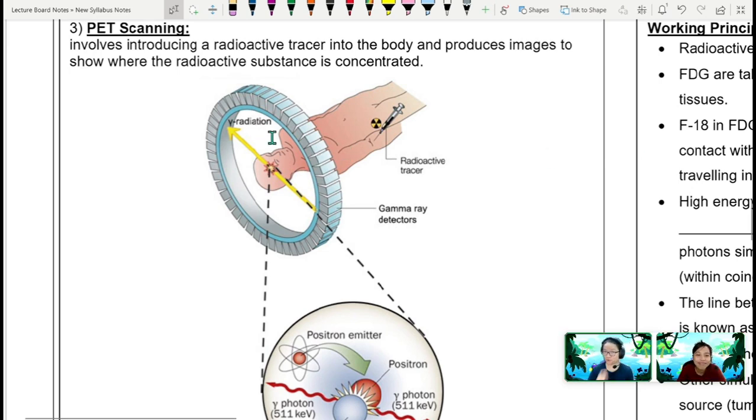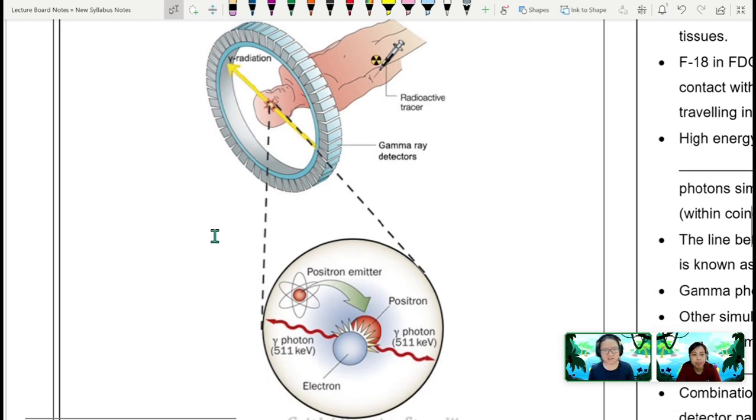Yeah, so if you're going to a hospital for a PET scan, first thing they will do is design the tracer for your body. They will take certain measurements about your mass, your weight, your age, and also how you metabolize certain compounds. So after some testing, they custom design a radioactive tracer, because remember, the radioactive tracer has a very, very short half-life. Today you go scan or today they make special one.